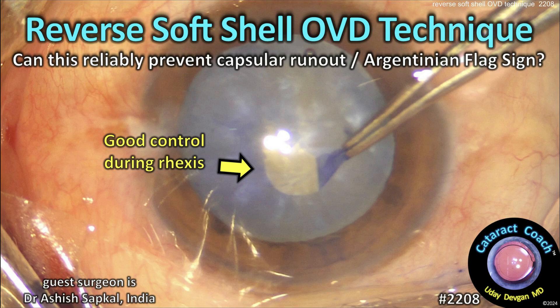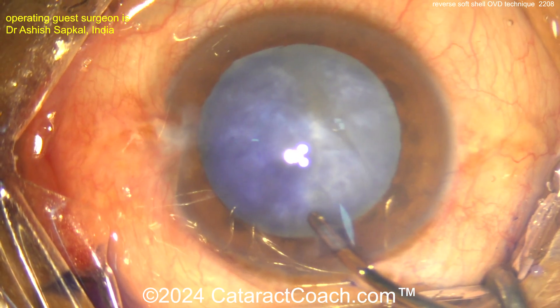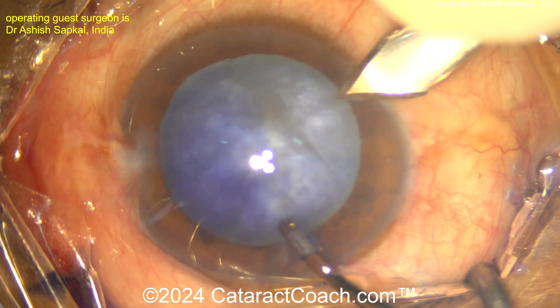From cataractcoach.com: reverse soft shell OVD technique — can this reliably prevent capsule run-out or the Argentinian flag sign? Let's watch this case. Our guest surgeon has a patient with an intumescent cataract and is now making a main incision.